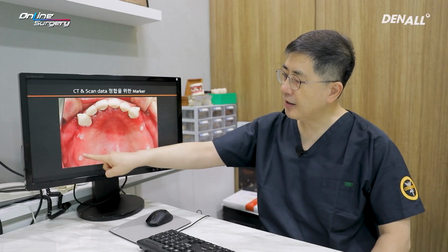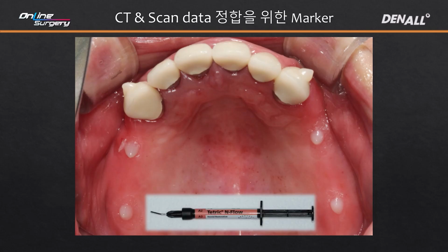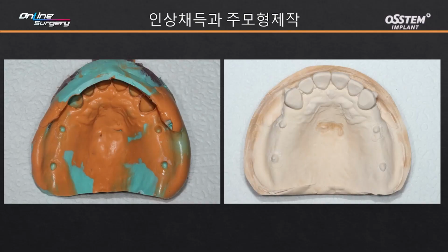In order to do guided surgery, you need to merge CT and scan data, and when we take a CT, you need to make resin marker to increase convenience when merging. I use a tetric flowable resin most to form these resin markers. At the time, there was no scanner, so impression was taken. Model scanner was used to get scan data. Silicone was used to take impression. Super hard plaster was used to make model.